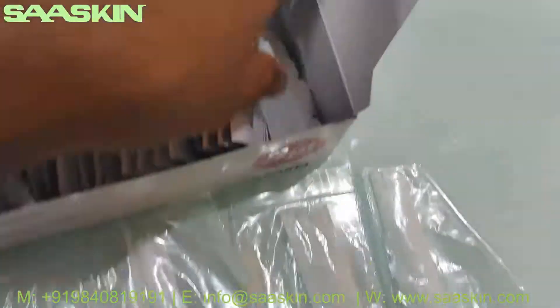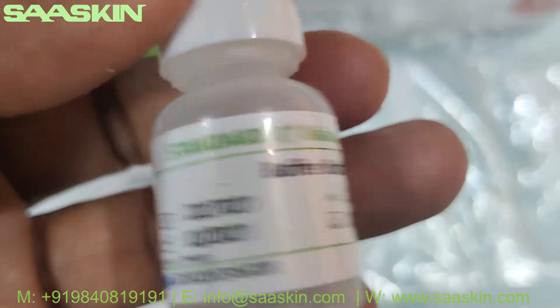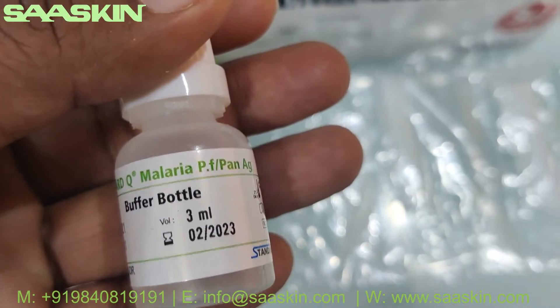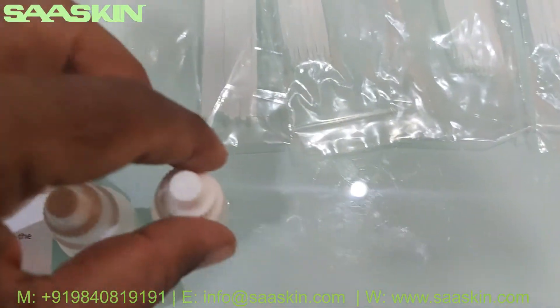And you have got a buffer bottle — 2 bottles of buffer. This is a 3ml buffer bottle. So you have 2 bottles of 3ml buffer.